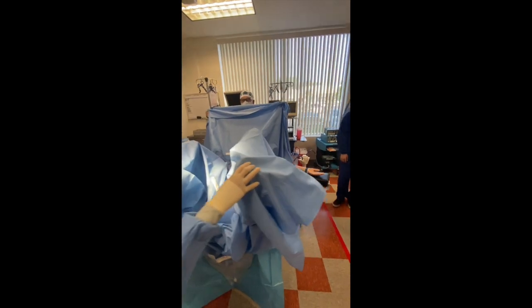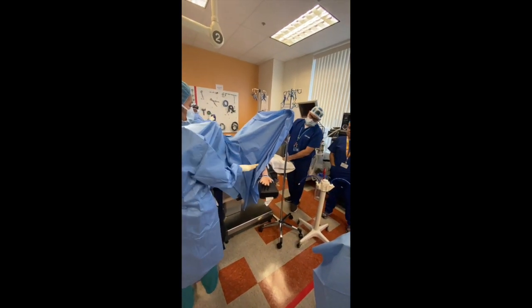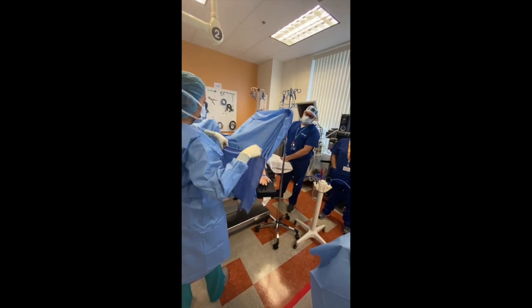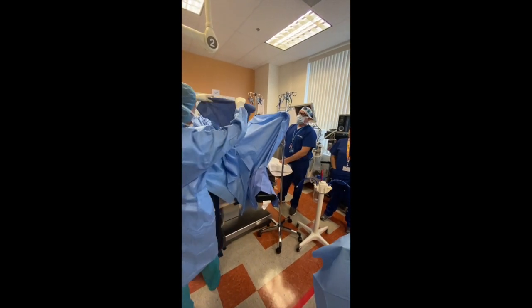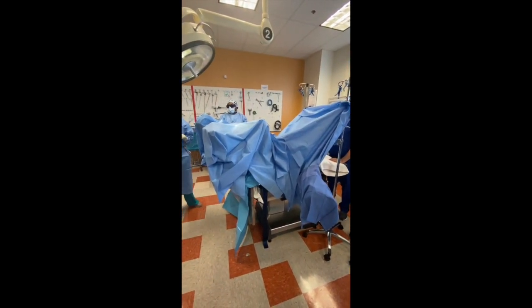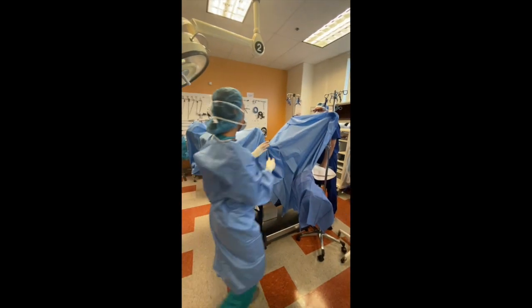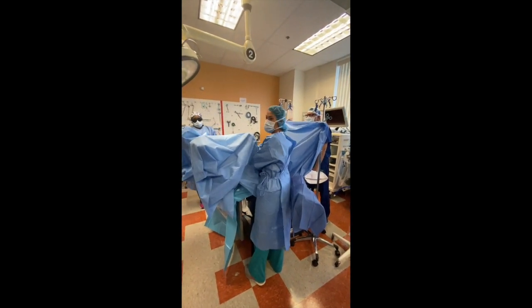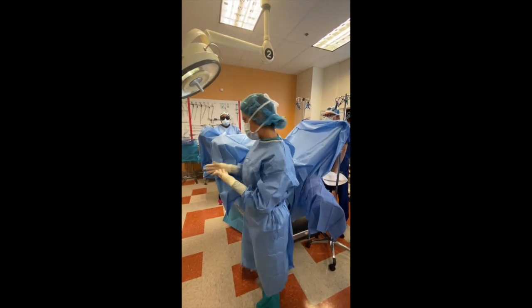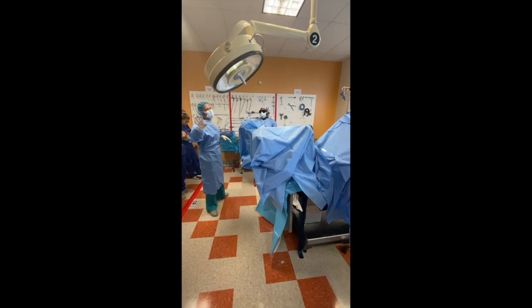This is shady town. May I have two towels, please? I'm not going to touch this because it's still contaminated. We don't care how you do it — just cover it, make sure it's all covered. It's not the end of the world if that's not covered either — it would only matter if we were doing a combined laparoscopy, someone up top and someone down below. Then this would matter.